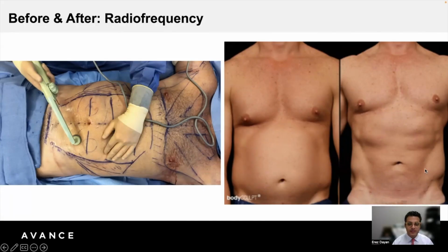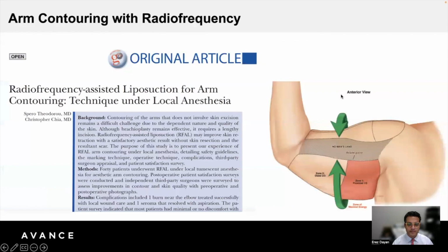So in the previous liposuction course, I showed you how we sometimes over-suction the semilunar line at the edges of the rectus muscle or the linea alba in the central line. But also what some providers do is high definition, where they will also essentially etch out the borders of the six-pack muscle and similarly take that same fat that's liposuctioned and graft it, fat transfer to the upper part of the pectoralis to give it more of a muscular appearance.